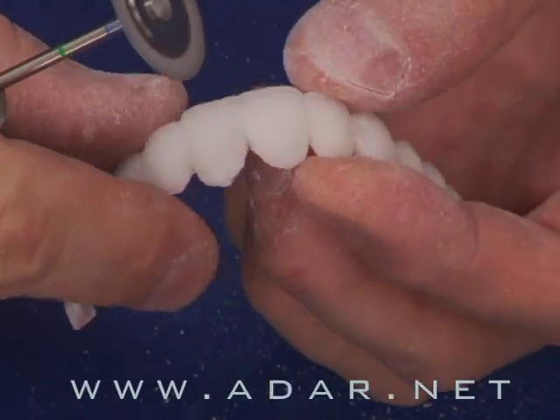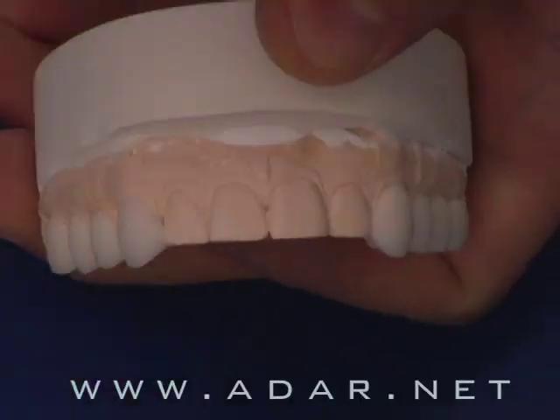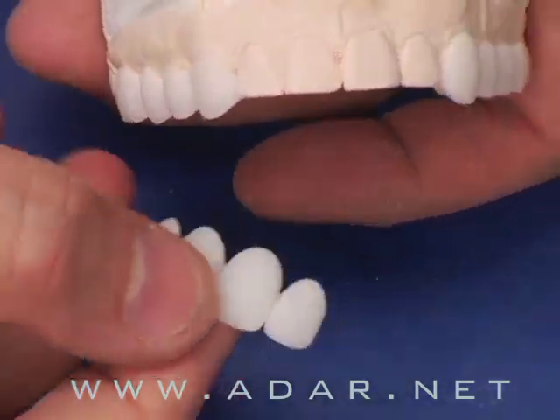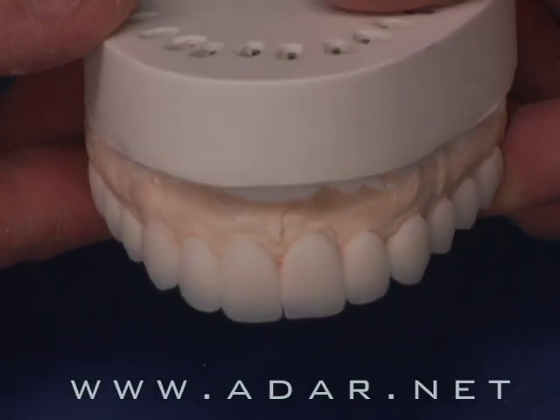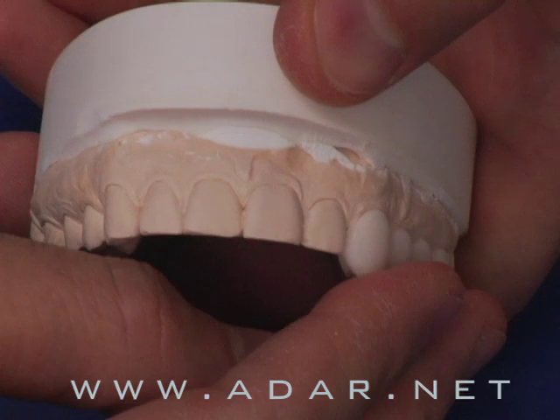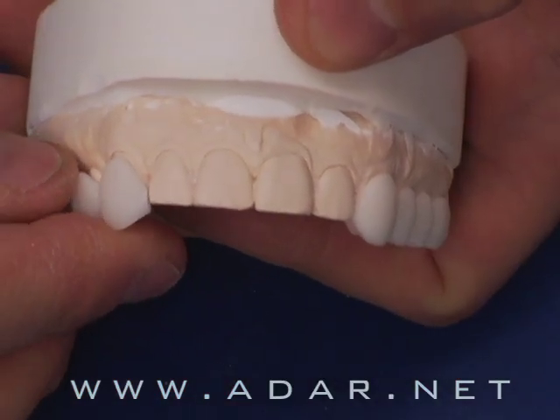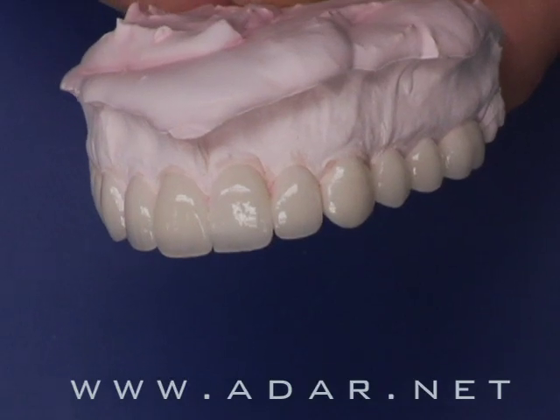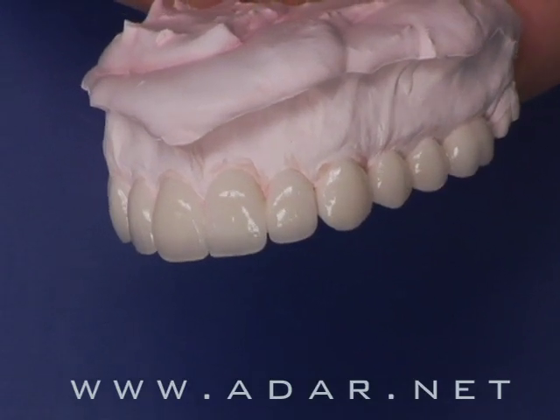I will teach you how to section those for reasons of path of insertion — in some cases when you need to split them into three pieces, or sometimes two. I'm also going to teach you how to glaze that or further enhance the effects by mixing ceramic stains to create this beautiful device, so it's three-dimensional not just in shape but also in color.